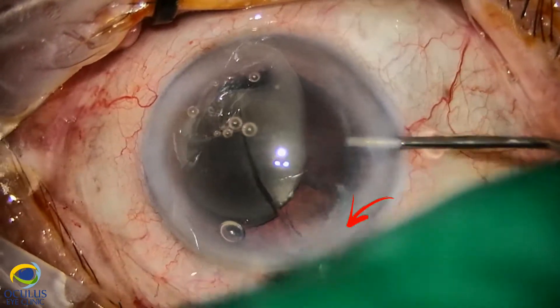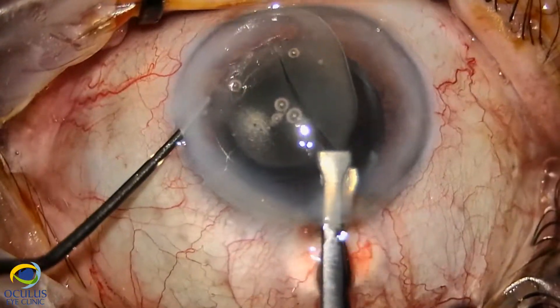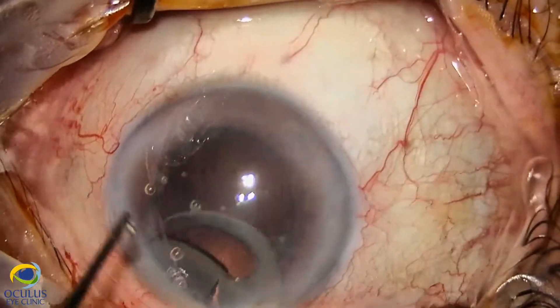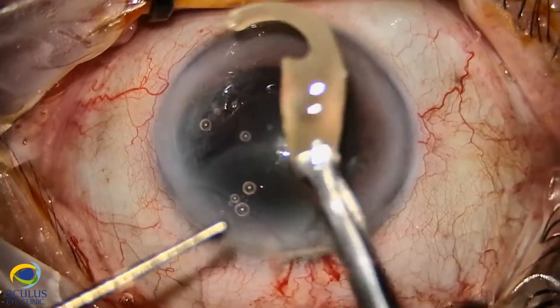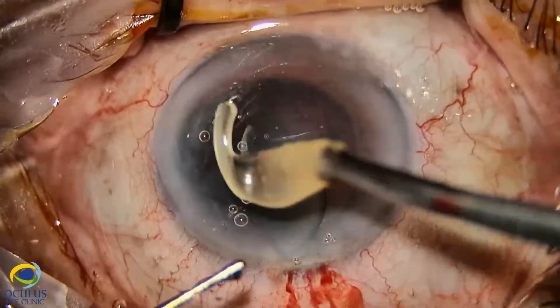First, we divided it into one third and two thirds. We withdrew the first third of this opacified lens. Look how opacified it is, and with a yellowish color.